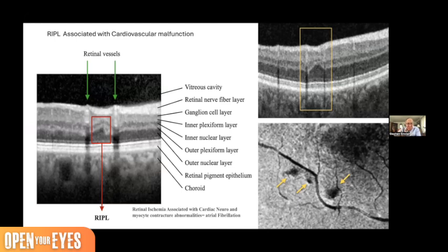So over there are the ripples, and those are associated with cardiovascular disease. There was actually a study that showed that if somebody has that, they're at a 6 times greater risk of having a cardiovascular event within 10 years on the atherosclerotic cardiovascular score scale. So those are these little ischemic spots in the retina.